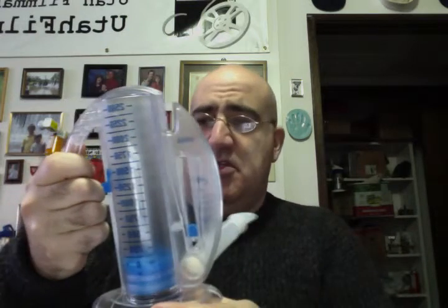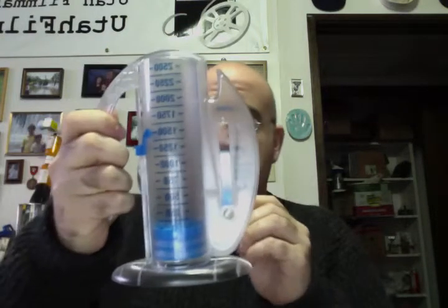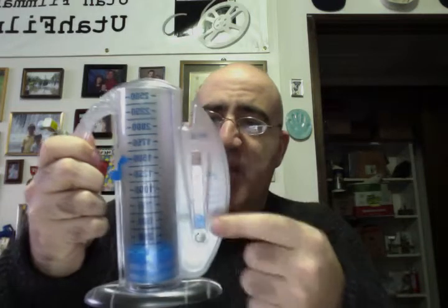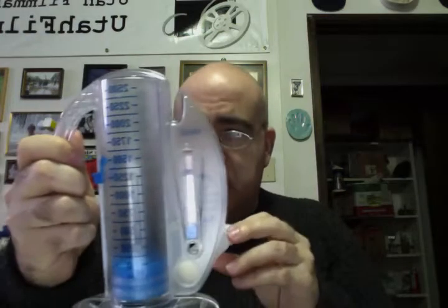I was going to demonstrate it for you. You put your mouth on this and you just inhale, and you watch the little device in there go up. It tells you how much you've breathed in. You also have to keep this little dial up between these two arrows here to make sure you're using it properly. I'll demonstrate.